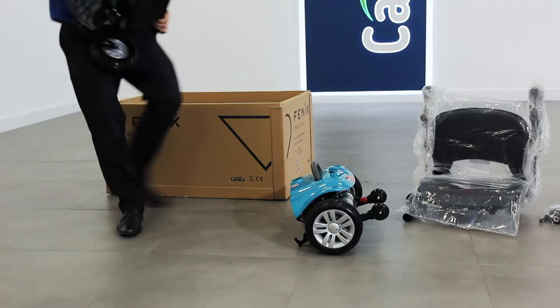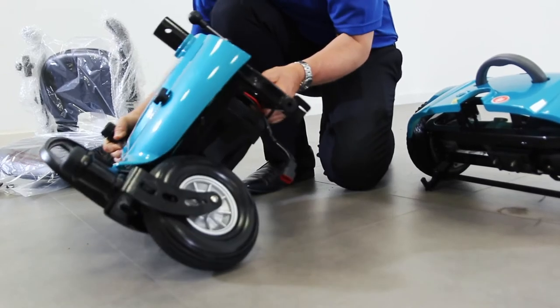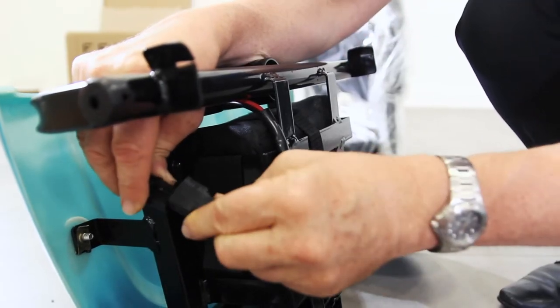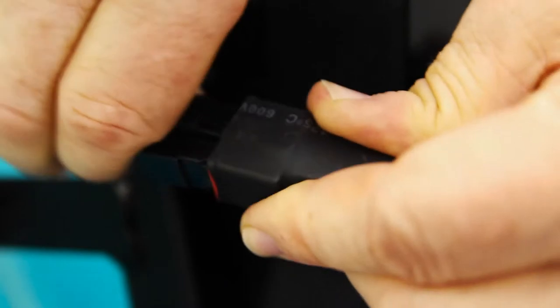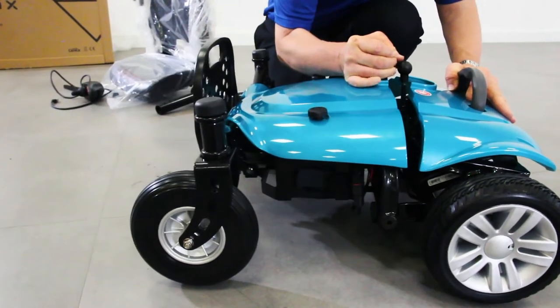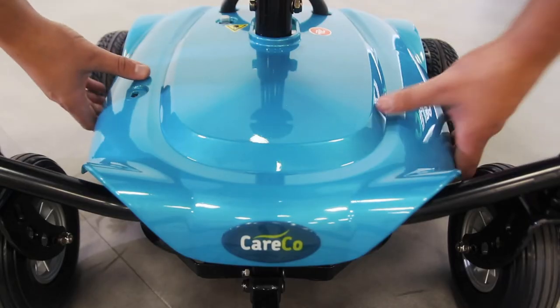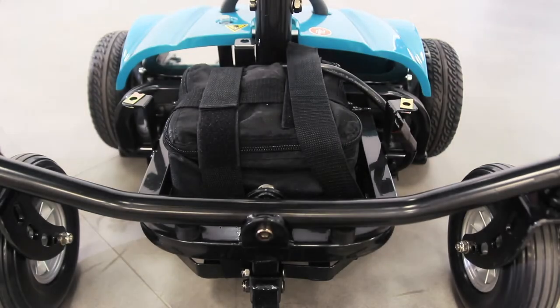With everything out of the box you are now ready to commence assembly. Underneath the front section you'll find two cables. Connect these cables to connect the battery to the motor. Now you can connect the front and rear sections back together again. To access the batteries for off-board charging or replacement you can remove the front cover.